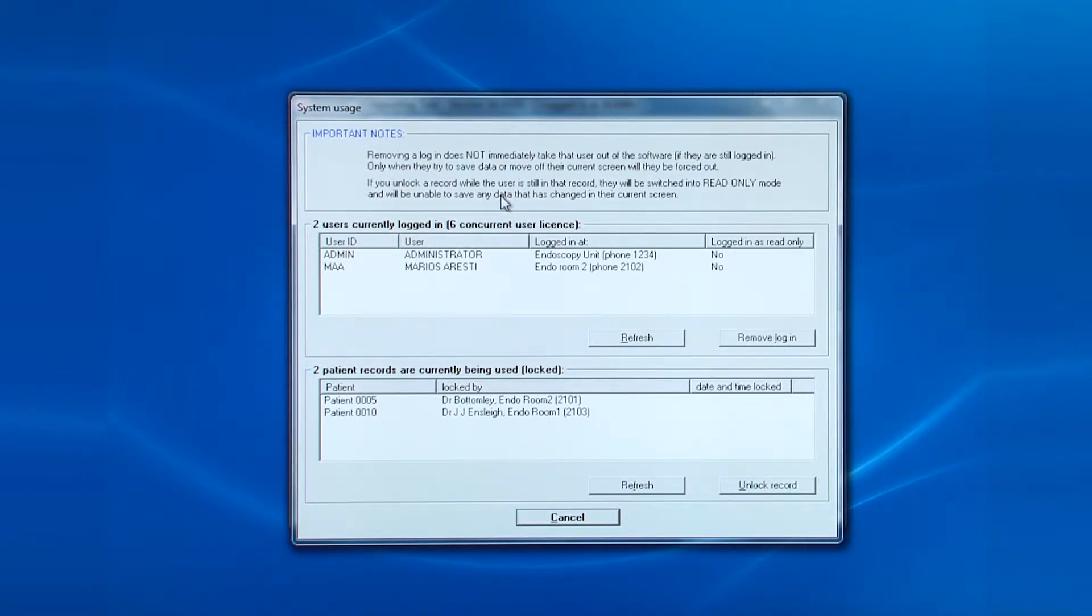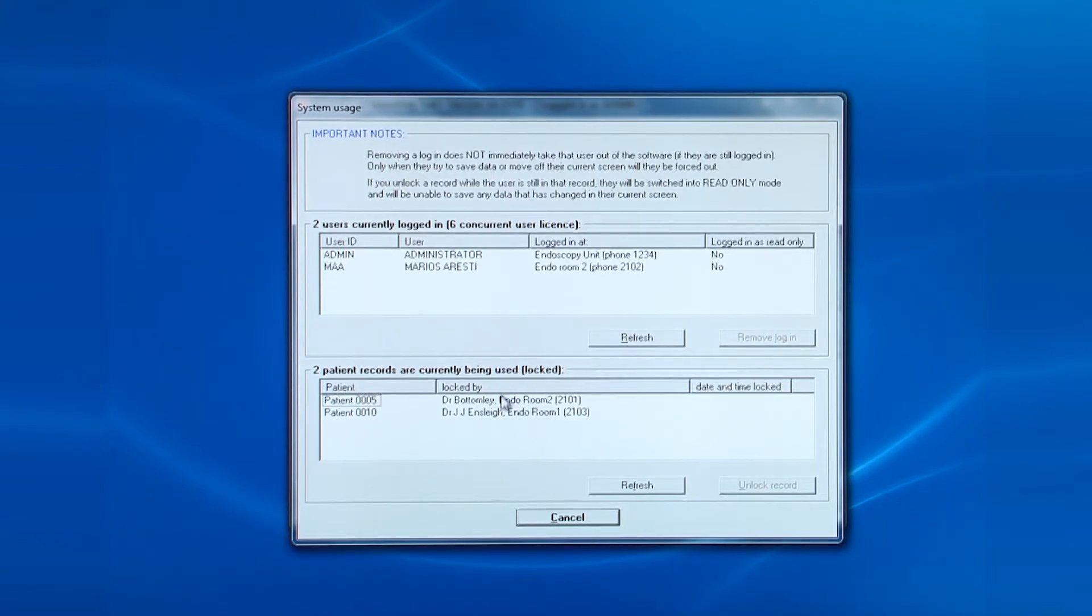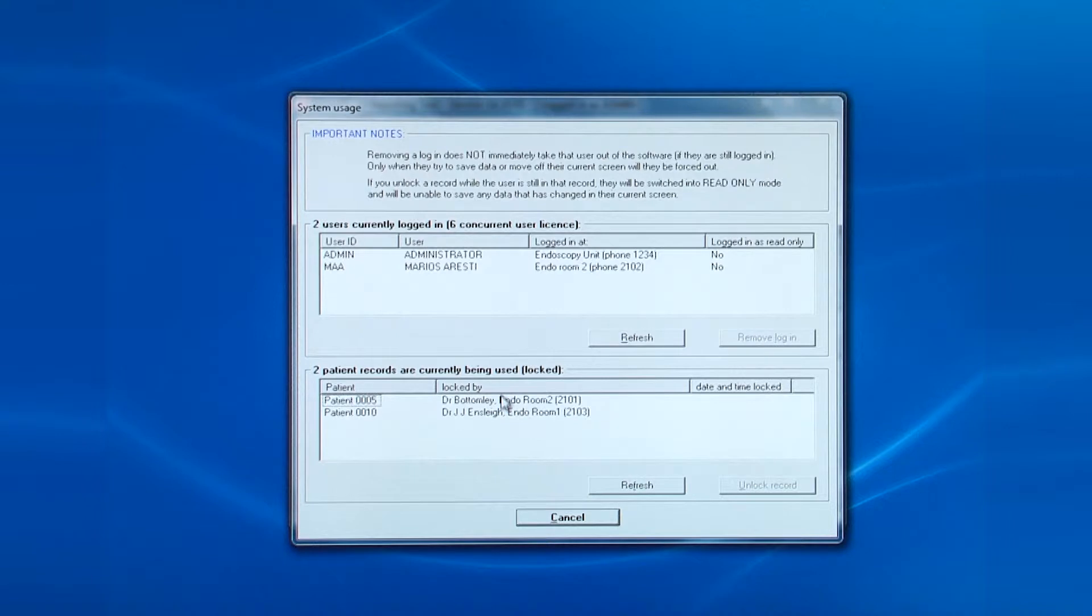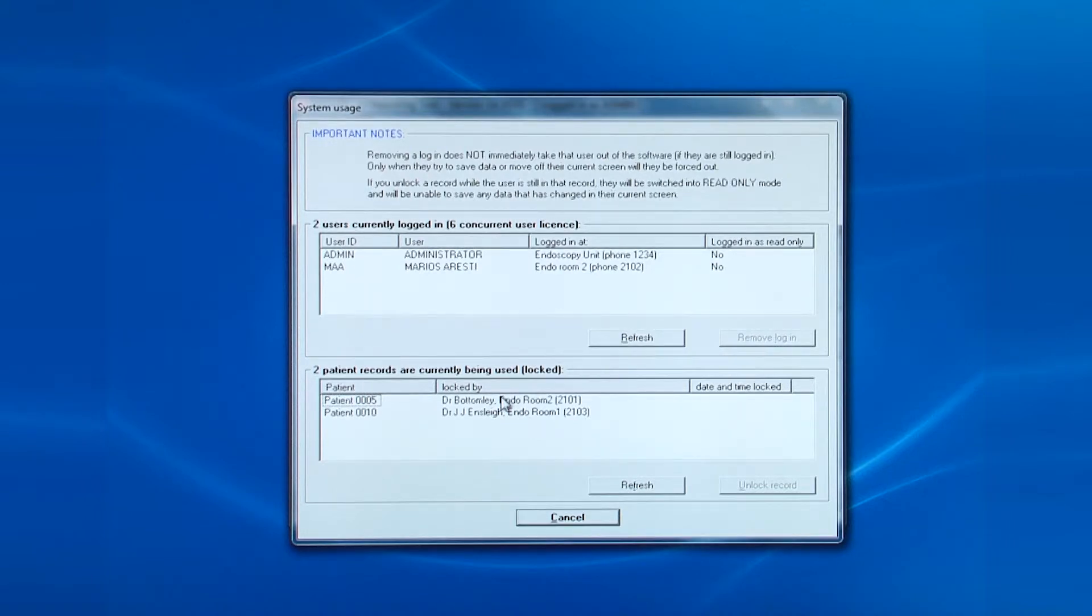It may still show a user as being logged into a patient record, not allowing others to access it. If that happens, you can click on the lock record and click unlock record.